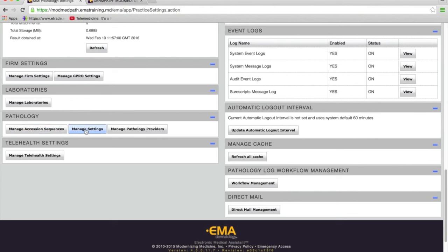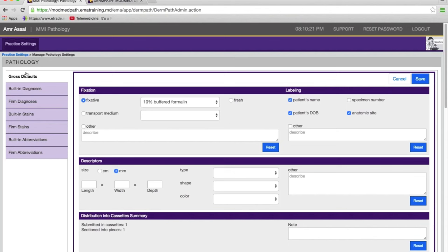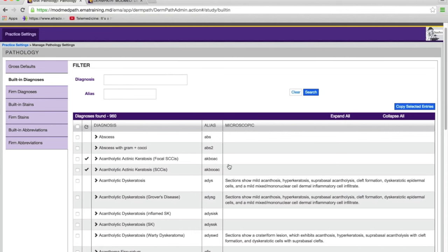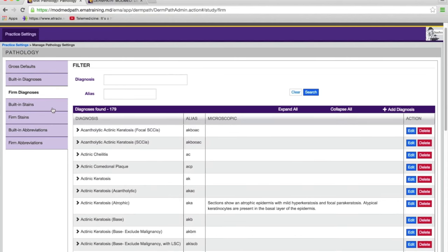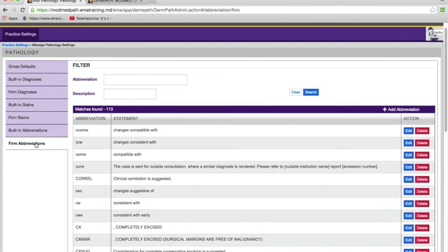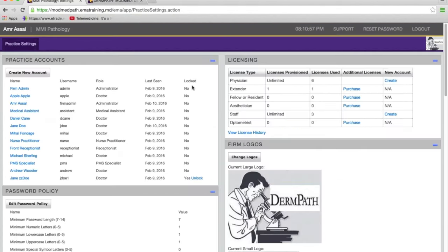You'll notice there's a manage accession sequence setting button, a manage settings button, and a manage pathology providers button. Here you can give any dermatologist slide reading rights. Manage settings gives you the ability to create defaults for the grossing stage. We also give you a library of about 960 diagnoses which you can copy, edit, and make your own. We also give you a bank of stains and a set of abbreviations or macros that you can edit or add to.